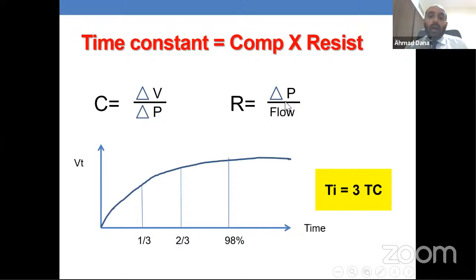Then another important point we need to understand. There is always a question: what sort of I time do I need to set for a small baby? Is it 0.4? Is it 0.35? Is it 0.3? Is it 0.5? Actually, there is a calculation which can help you.